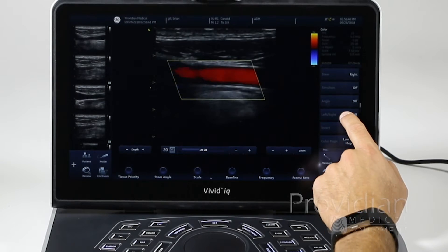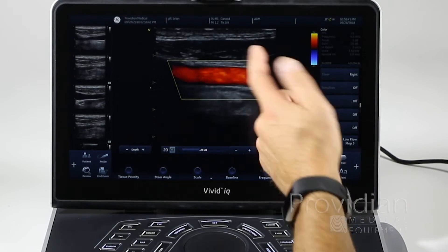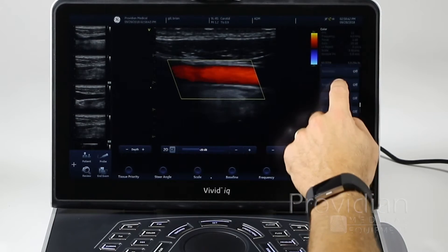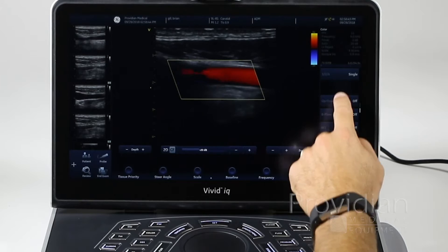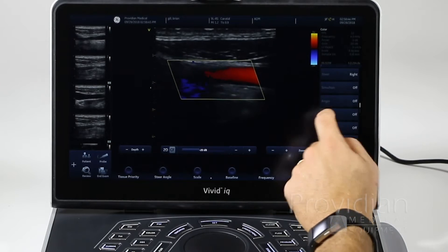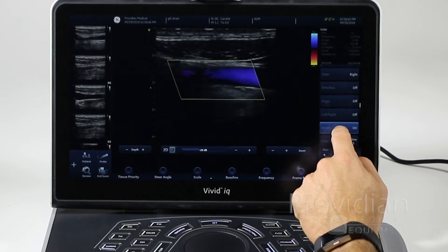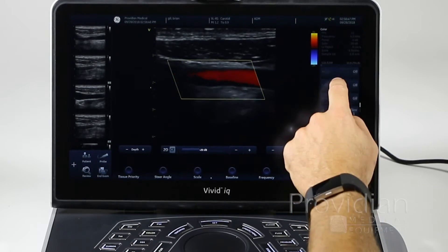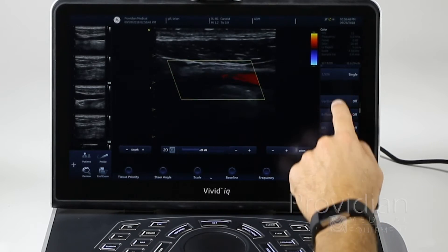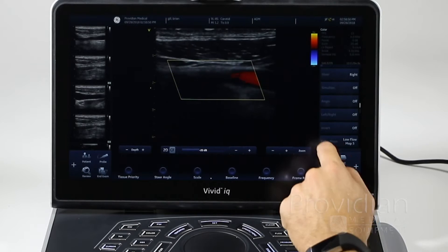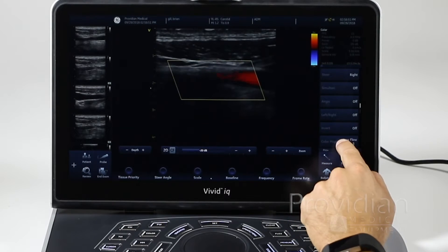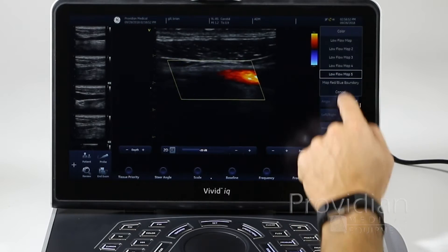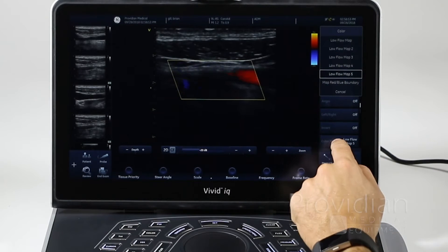Left and right inverts the image just like before. Invert inverts that color. Your color maps are right there — low flow map 5 — and you can choose one there.